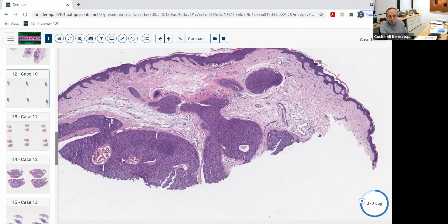Not the world's best name. There's very little ductal differentiation in here, and it doesn't tell you what kind of differentiation it is. So whoever named that, we probably should rename it. But we won't do that today.